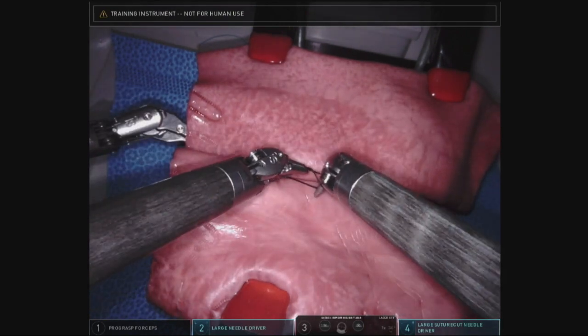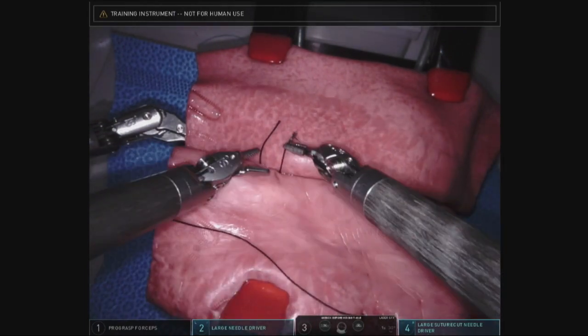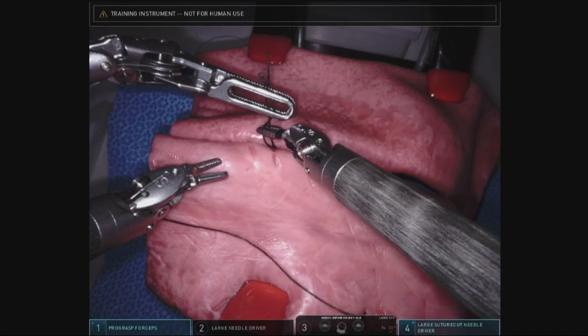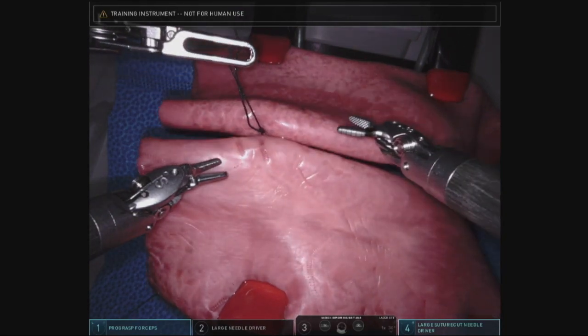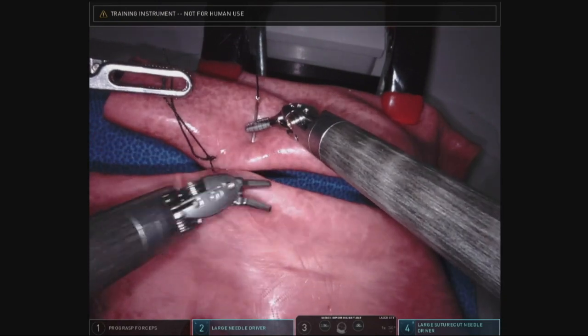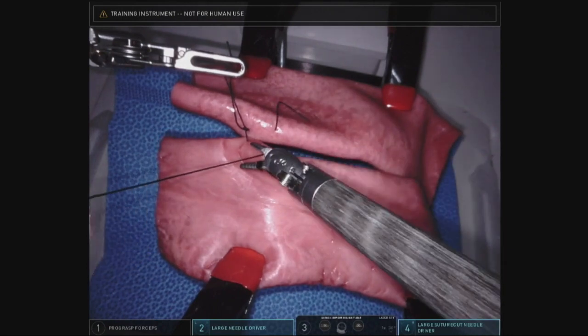The posterior row stitches will be similar to the previous exercise on the skin model, interrupted silk sutures. For the first stitch, after I tie it, I hold it with the third arm because it brings the side of the bowel anteriorly, making it easier to put subsequent stitches.